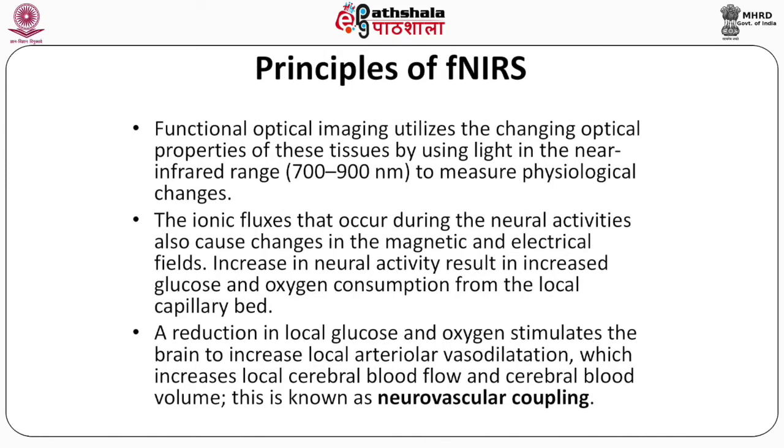So, the first and a pretty important topic of this module is the principles of fNIRS, under what mechanism it works.